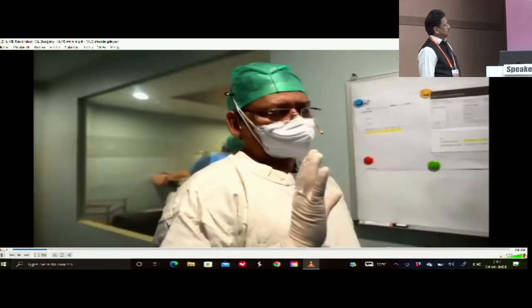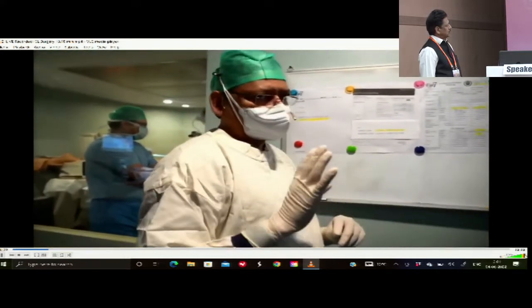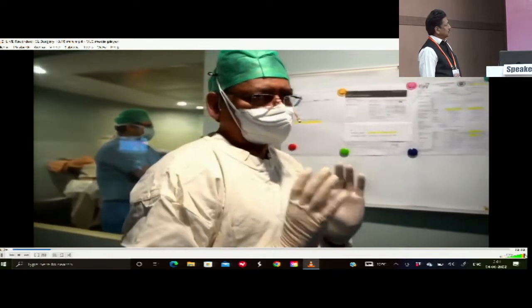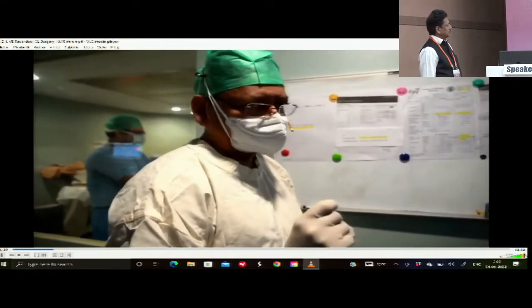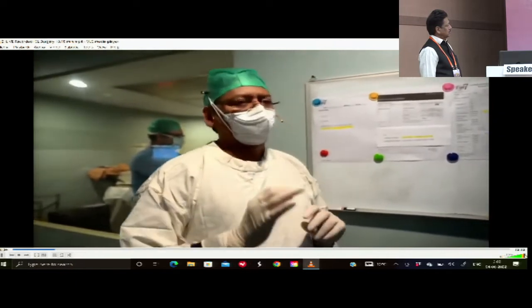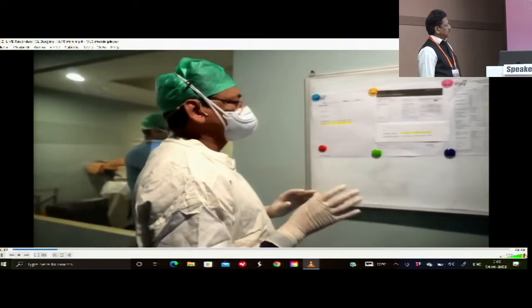So you made a mental calculation that this is what the power should be. You checked with a file that this is what the power is. So you're sure you're putting in the right lens at the right power. Many a times with multiple lenses, somebody could give you the wrong lens. So this is a very good practice, to make a mental calculation of what power should be there. This is a simple method.